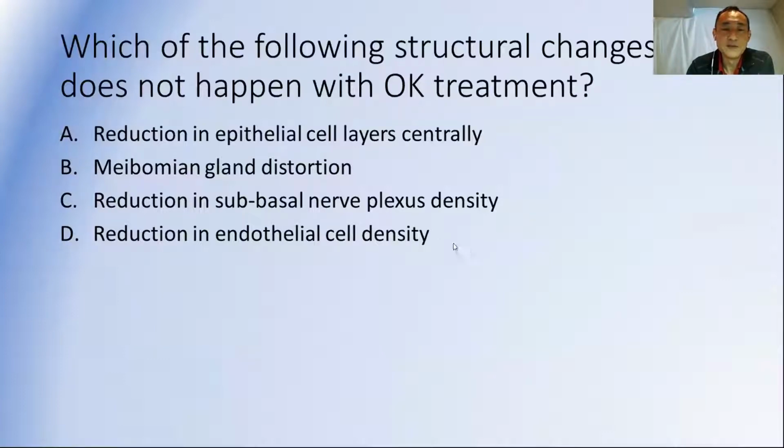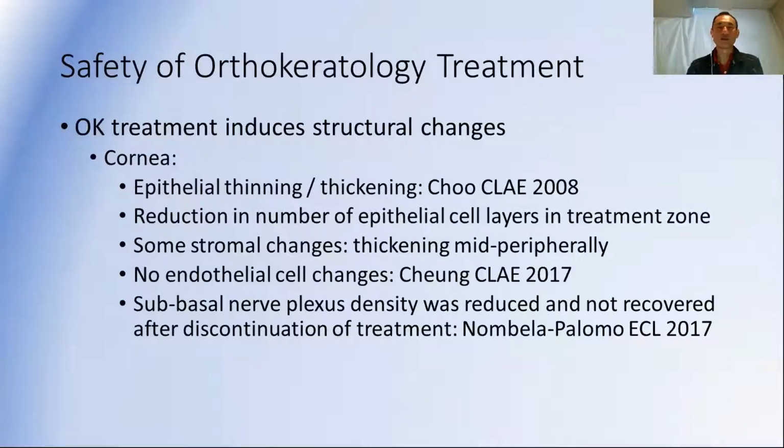But at least we've seen that there really is not a reduction in endothelial cell density, so we shouldn't have any issues with corneal edema or other long-term corneal issues over time based on endothelial problems. Several studies have looked at the safety of Ortho-K. I'll just go through a few of these findings.